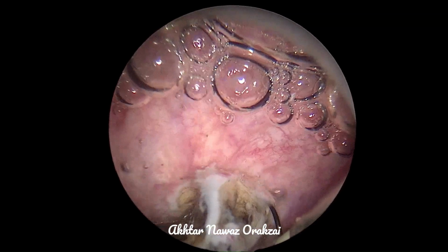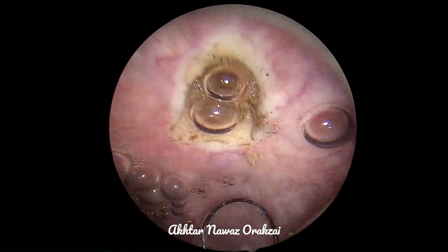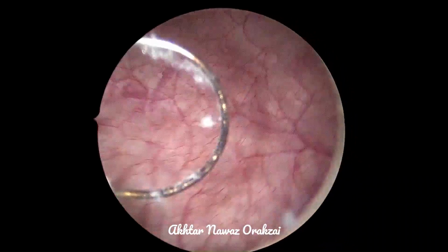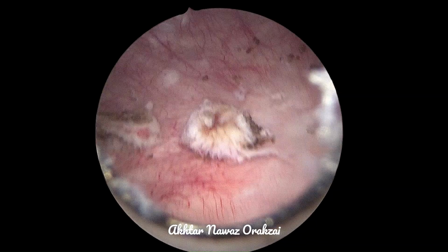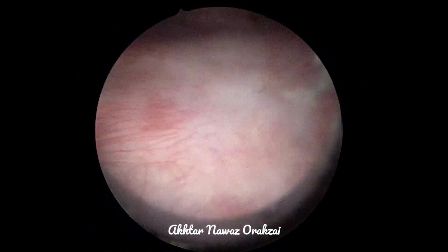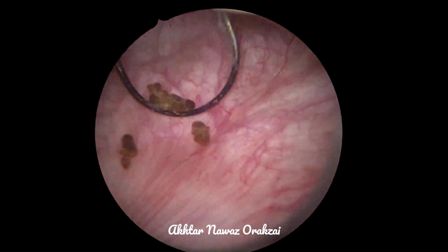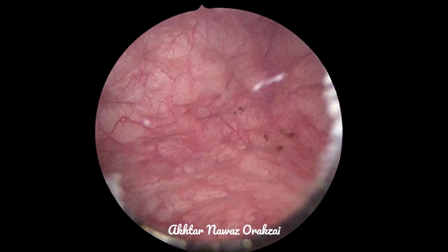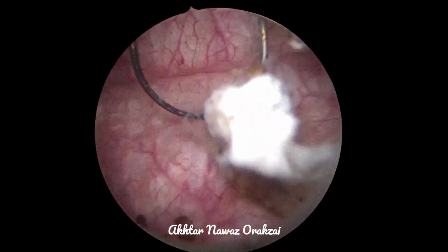So I was talking about the newcomers and the beginners and the residents, that they usually do cystoscopy while they are very close to the mucosa, even rubbing the mucosa. So number one, they can miss any tumor somewhere in the vicinity, which is not visible if you are too close to the mucosa or the bladder wall.